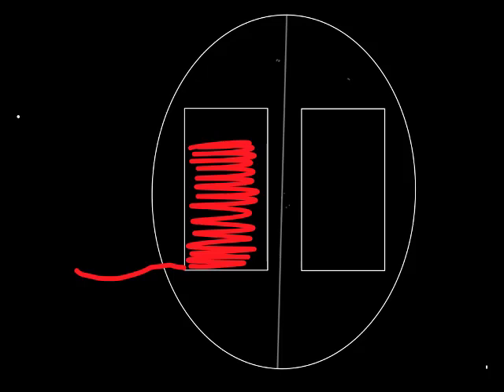So we have the blood coming in at a certain cerebral blood flow, and it's filling up the tissue to a certain cerebral blood volume. Now, it took a certain amount of time for me to draw in the blood flow coming in from the vessel and filling up that volume. The time it took to fill up that volume till it reaches its peak is the time to peak. And then eventually the blood is going to leave that volume of tissue through the veins.